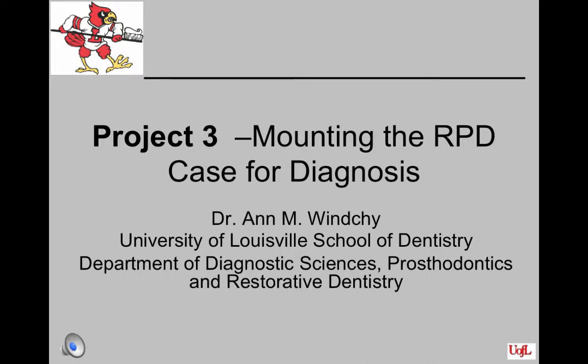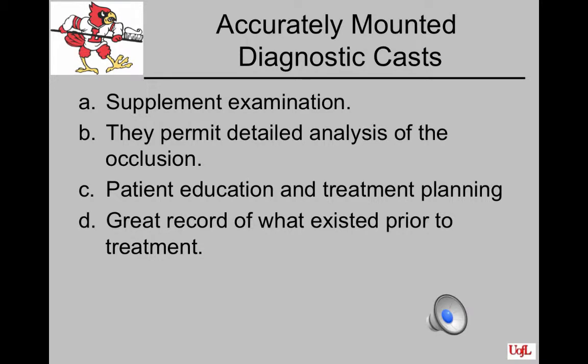The steps that you're doing on the Dentoform simulate what you would do to a patient to mount a case for diagnosis and treatment planning. When we have mounted diagnostic casts, we can have the following. We can supplement our examination.